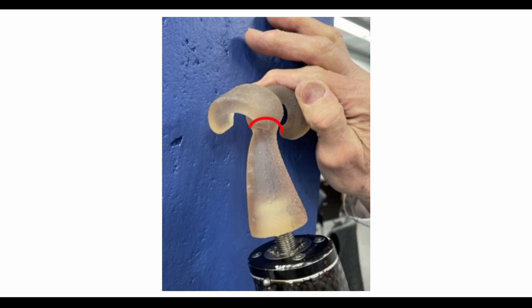With our sixth iteration of the Golf Helix, which was one we felt pretty confident about, we invited Bob to come down and test it at the Varsity Golf Studio. And we were excited at first because things were working pretty well, but then we noticed that there was a tear in the Helix, which looking long term would not be a very good thing for durability of the product.